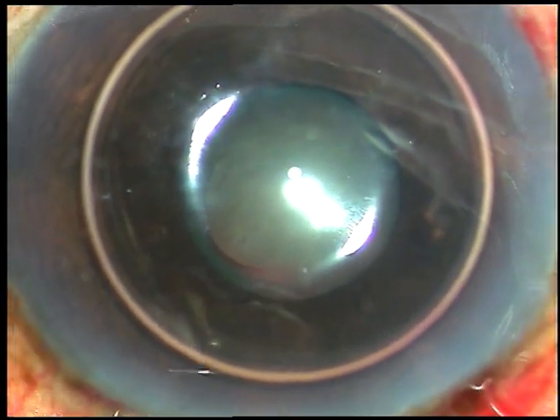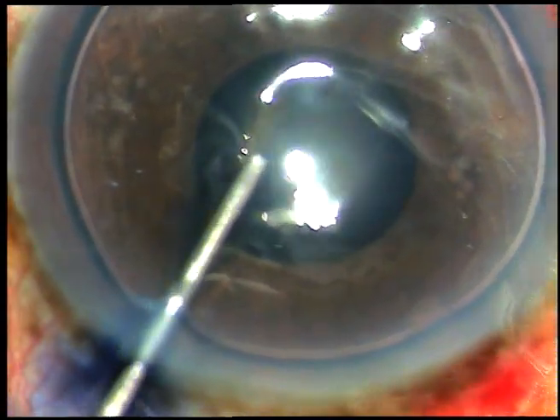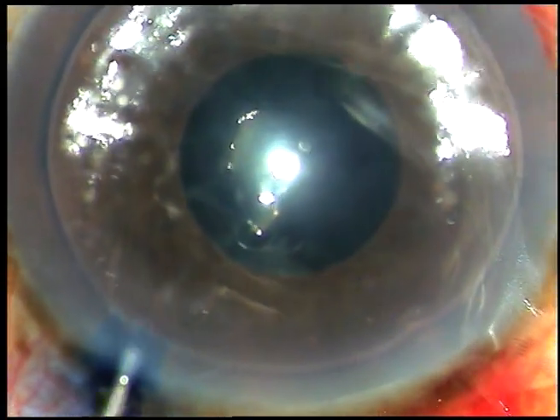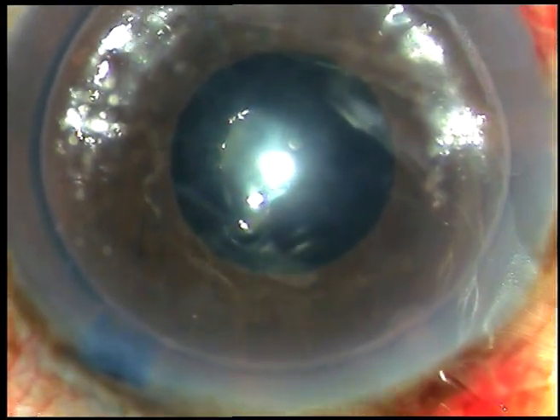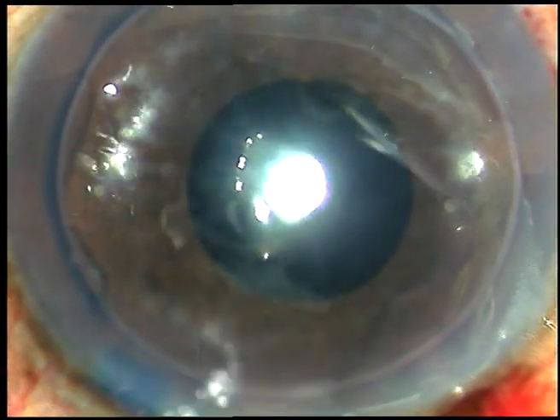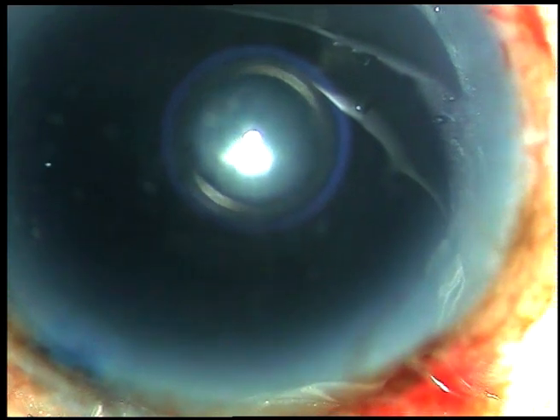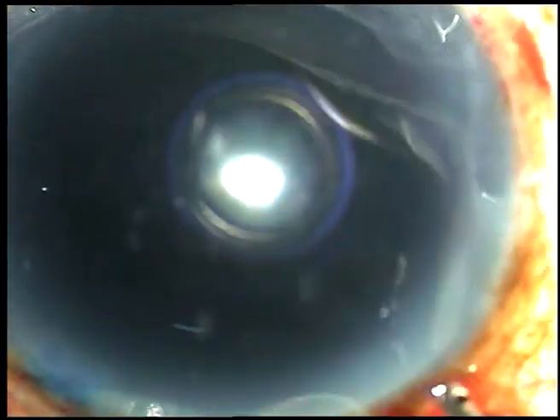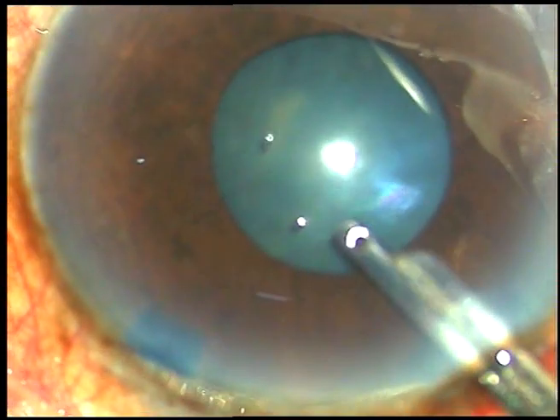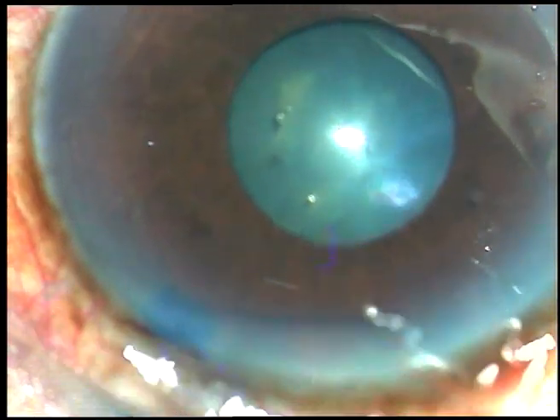I've taken up this case for surgery. By this time, all the incisions have been made. Now the capsule is being stained with trypan blue dye. A little bit of dye has been injected underneath the iris. Now this is a bit of adrenalin — I want to see if the pupil dilates. And after washing the dye out, I can see that the pupil has not dilated.